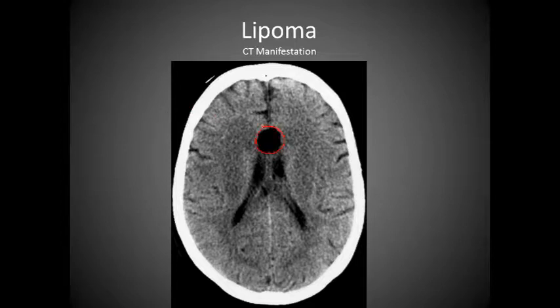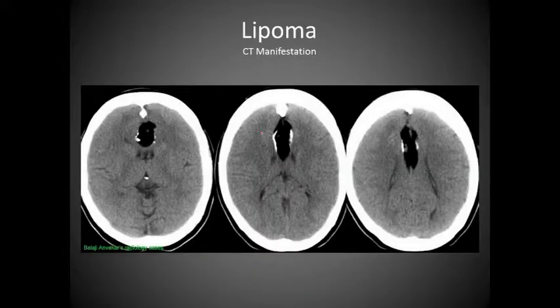Here's another area. Notice the location. It's usually in the center, in the midline of the brain, and it just has these rough, indeterminate borders. But other than that, nothing really demonstrates to be very menacing at all. So here is lipoma as you're scanning through the patient. This is image 1, 2, and 3. And so we see that we have a lipoma here going in the midline.